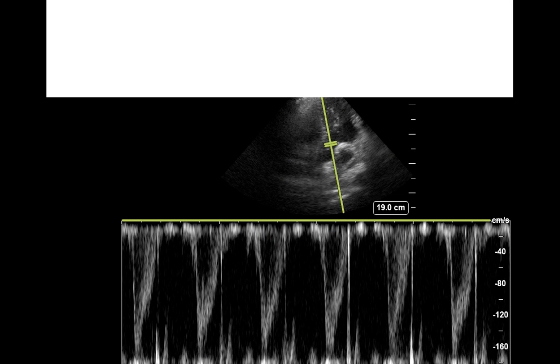You can use Doppler to objectively measure velocities. There are two options that you can use: pulse wave or continuous wave, PW or CW. Pulse wave, or PW, will measure between the two marks on the line. This is an example. I hit pulse wave, and a line appears, and here are my two parallel lines. Continuous wave will measure the highest velocity anywhere along the line, as compared to between the lines, between these markers.